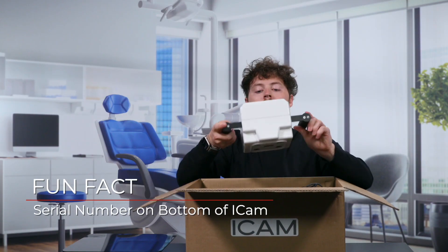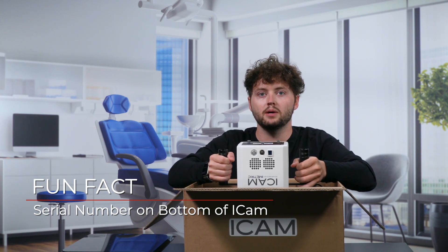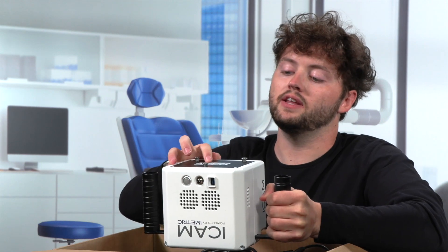Now the iCam 4D is the big white component in the middle of your box. The camera will be facing down and labeled iCam, powered by iMetric. Let's grab the iCam by the two black handles coming from the sides and place the iCam on a steady workspace. If you look at the bottom of your iCam, the serial number will be provided. You'll need the serial number when you talk to any iMetric support personnel.